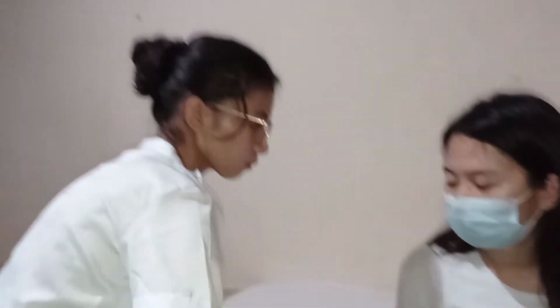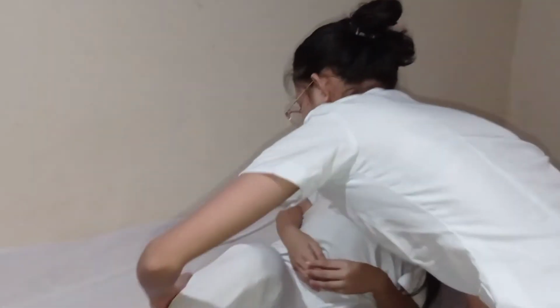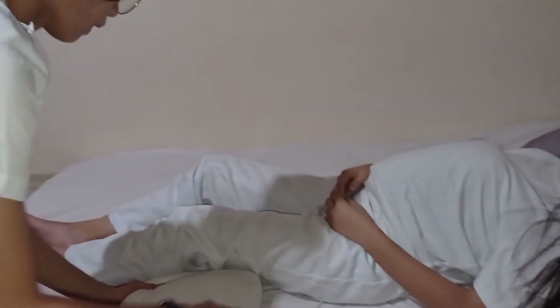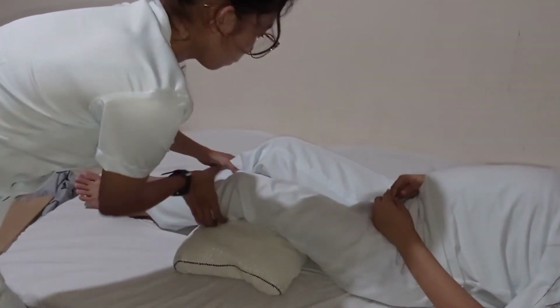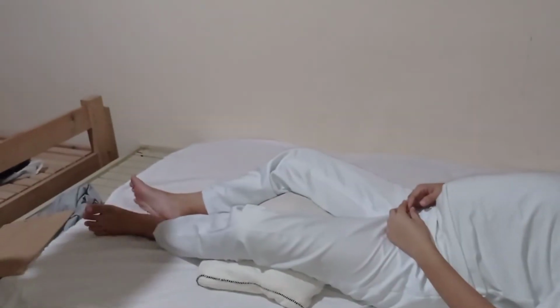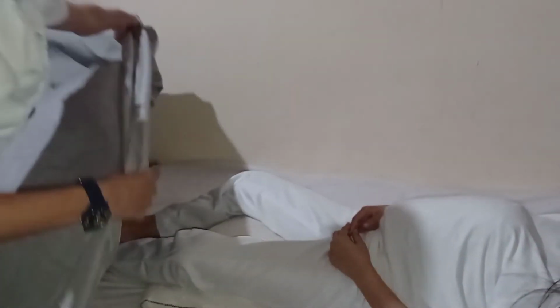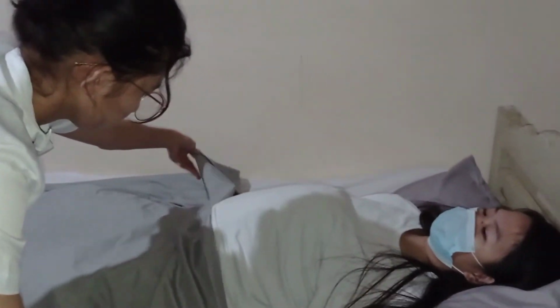So the next step is to perform hand hygiene and observe infection prevention and control. So the next step is to prepare the client and assist her in supine position while the knees are slightly flexed. So put a pillow or a rolled towel under her knees. Then provide privacy to the patient while draping properly.